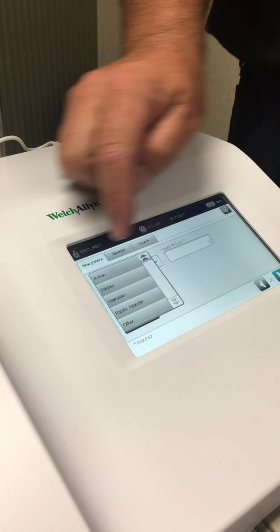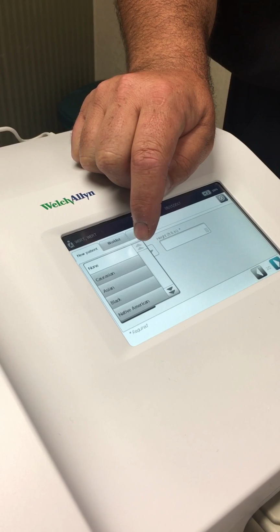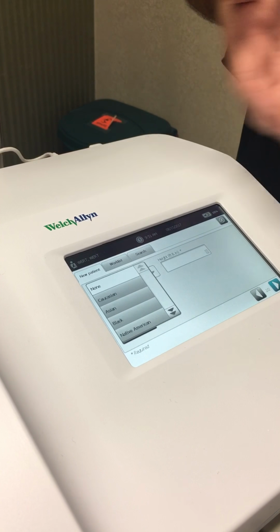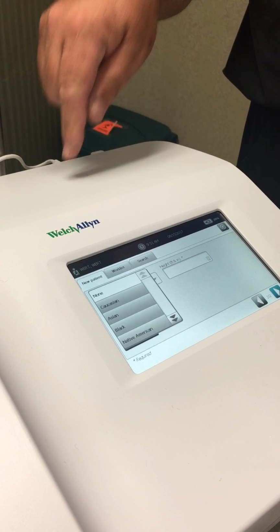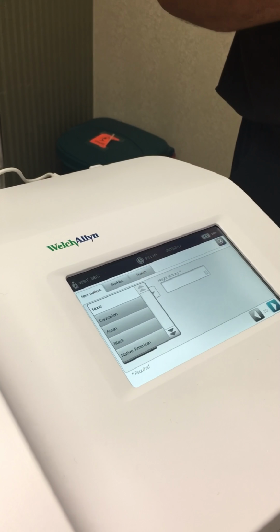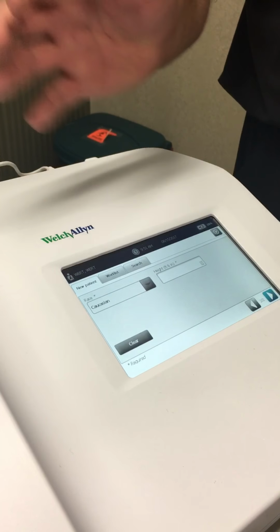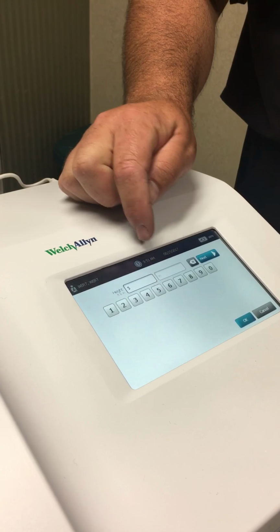Same thing for me, when you look, Middle Eastern. I'm a Middle Eastern guy, right? So Middle Eastern is not on here. West side of Cleveland, I was doing this same presentation, same training, and Doc was Middle Eastern. I'm like, Doc, what do you want me to do? He said, Middle Eastern lung volumes mimic Asian lung volumes. So he had me pick Asian. He's always known Asian. I've always done Caucasian. That's what I know. I know my results. It's consistency. It's going back to that trend over time. So that's very important. Height. So I'll do 5'1".